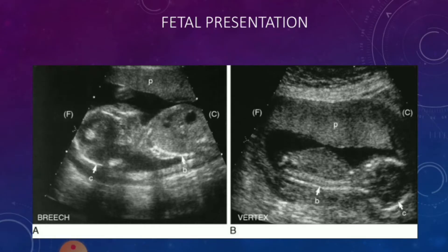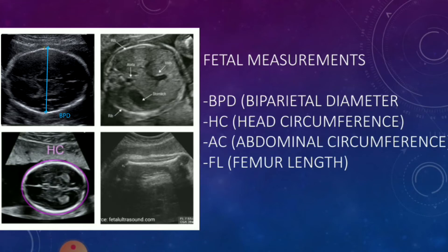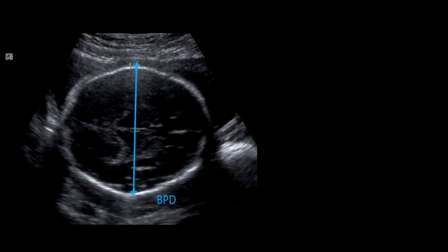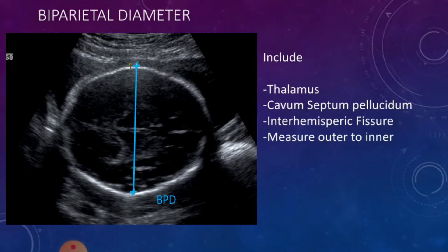Once you're done with that, you want to begin with the brain or the fetal head and continue in a head-to-toe fashion. You're going to take four measurements of the fetus, and these measurements will help you determine the estimated fetal weight and gestational age. Beginning with the head, you're going to get a transverse view at the level of the thalamus, choroid plexus, and the cavum septum pellucidum.